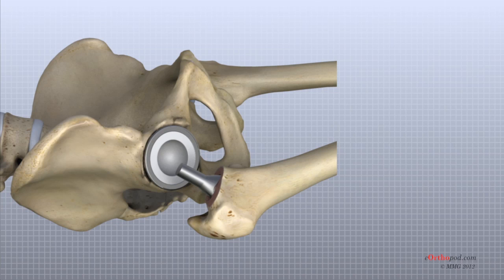In the uncemented variety of femoral component, the stem is held in place by the tightness of the fit into the bone, similar to the friction that holds a nail driven into a hole that is slightly smaller than the diameter of the nail. In the cemented variety, the femoral canal is enlarged to a size slightly larger than the femoral stem, and the epoxy type cement is used to bond the metal stem to the bone. The metal ball that makes up the femoral head is then inserted.